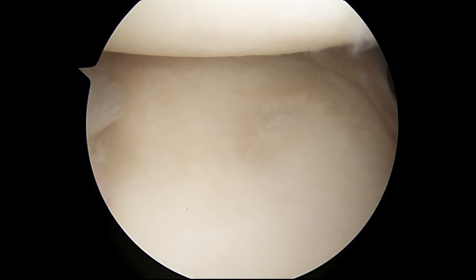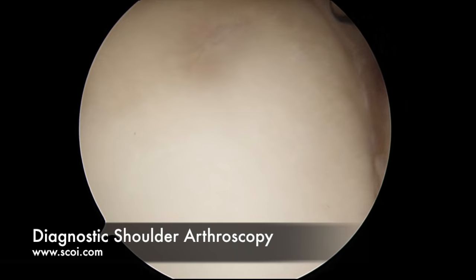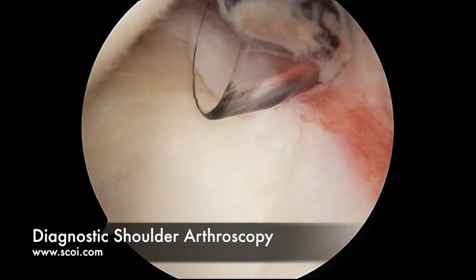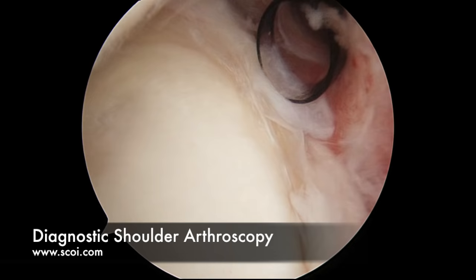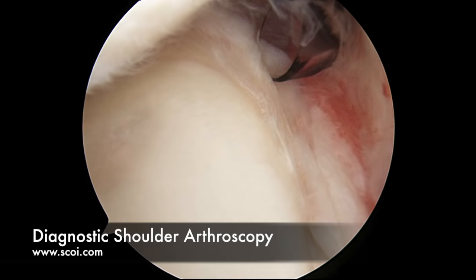Now the second part of a diagnostic arthroscopy is with the arthroscope in the front of the shoulder. We're looking back across the shoulder with the ball up above and the socket down below. This structure right here is the labrum — the ring of tissue around the socket. There is a little bit of degenerative fraying here, but all in all not bad — it is age appropriate. As people get older their labrum degenerates, and they may have findings of labral tearing on an MRI scan when clinically it does not cause pain. If you were to try to repair a degeneratively torn labrum, the shoulder is quite likely to get worse.